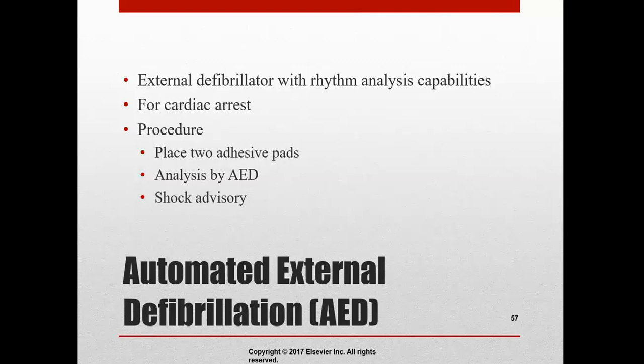To use these, training is included in BLS courses, so that anyone can really use the device, and then always ask someone to activate the emergency response system if the device is ever deployed. In a hospital setting, you're always probably going to have extra hands on deck. Somebody else is probably going to be handling it, probably your charge nurse. But if it ever happens out in public and you're using one, it's really important to make sure that somebody calls 911 and you get help as soon as you can.